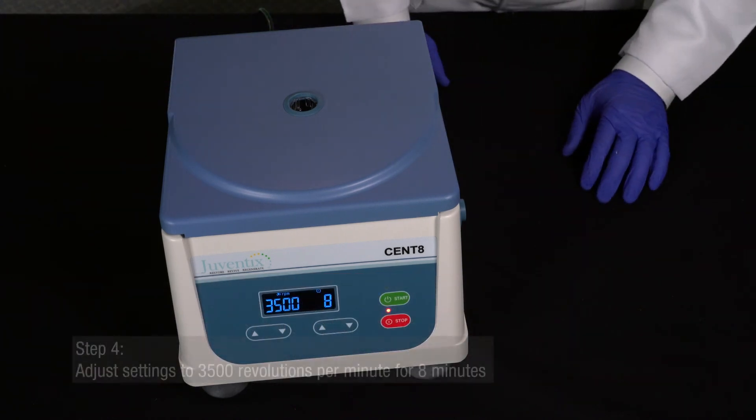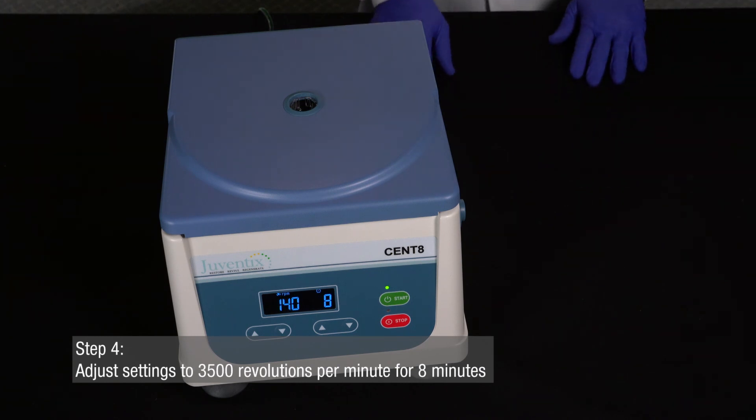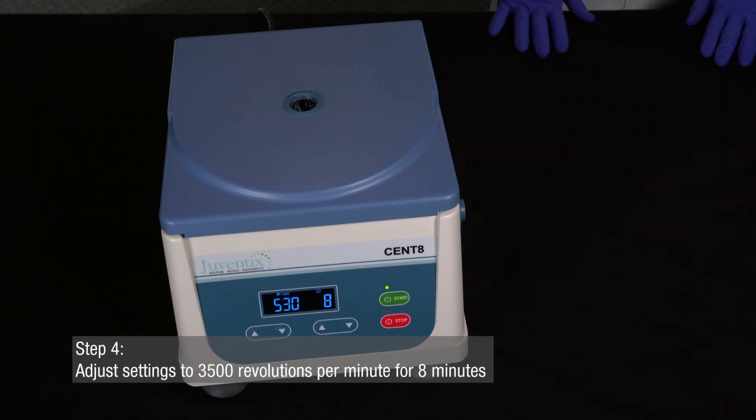Using the up and down arrows on each side of your Juventix Regenerative Medical Cent8 centrifuge, adjust the settings to 3500 revolutions per minute for eight minutes.